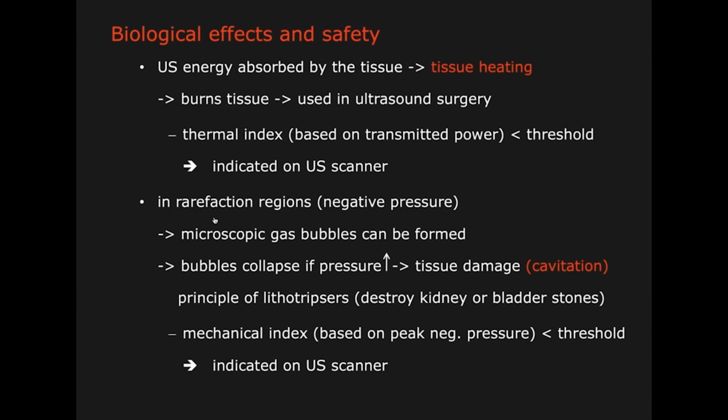Generally, ultrasound is a very safe modality. So we actually call it non-invasive imaging. However, we have to keep in mind there are still some interactions with tissue. The first thing is, of course, because of the attenuation, we have heat generation. If we use a huge amount of ultrasound energy, we will actually heat the tissue. So there is a maximum index, called the thermal index. There's a maximal amount of energy that we can use for ultrasound to make sure that we don't heat up the tissue.